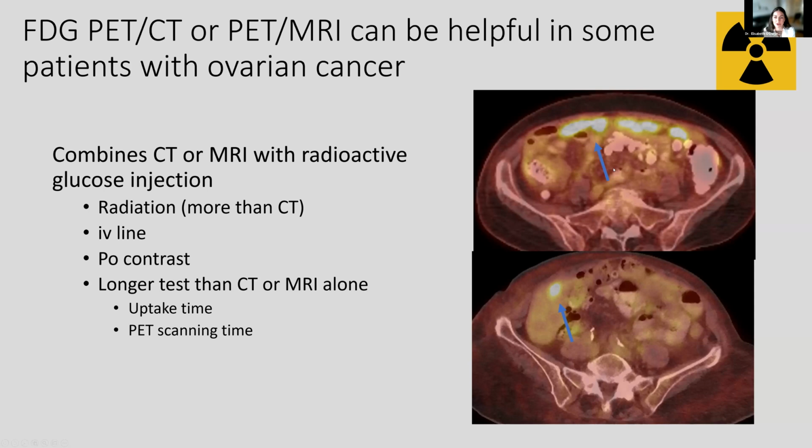The CT is predominantly designed for anatomical localization and is not a diagnostic CT like you would get for a CT abdomen and pelvis, which we give with contrast. We don't typically give IV contrast with these studies because it's not a diagnostic study, so we're not doing it for timing purposes. Although the CT can be helpful for identifying things, it does not replace a normal diagnostic CT.